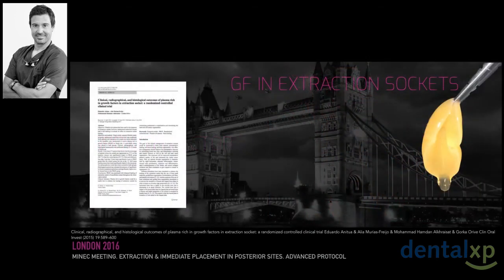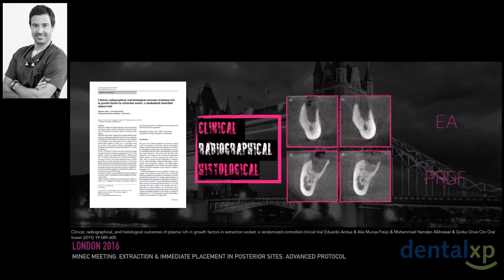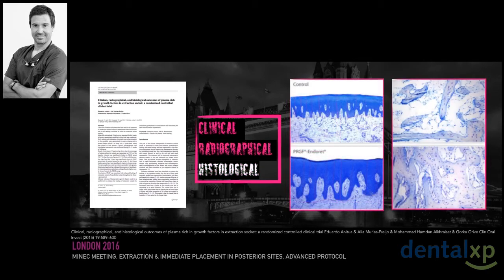This article, and many others from Eduardo Anitua, Robert Marx, and Joseph Choukroun, compares the use of fraction 2 of the growth factors, the richest part, in fresh extraction sockets versus extraction alone, and the results are significantly different. Clinically, a significant difference was observed in terms of volume changes in areas treated with PRGF. Radiographically, the ridge was preserved, looking at the CBCT, as well as the soft tissue quality in terms of keratinized tissue and more mineralized bone at the sites treated with growth factors.